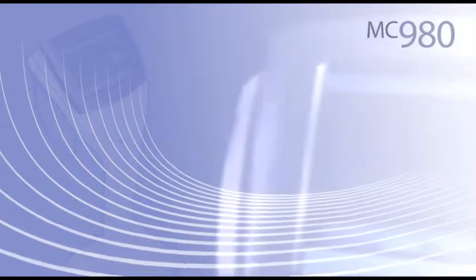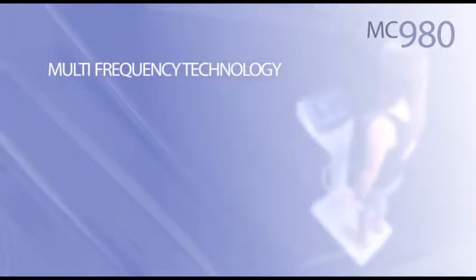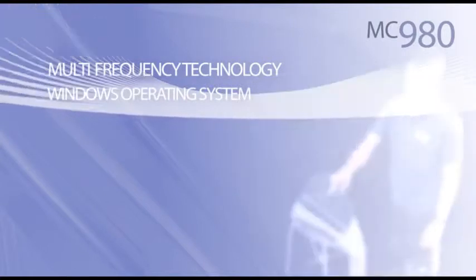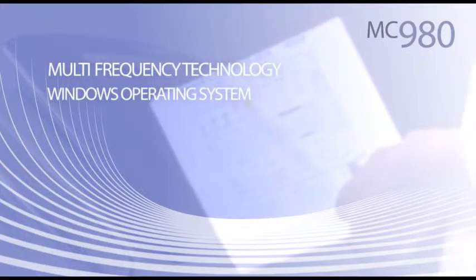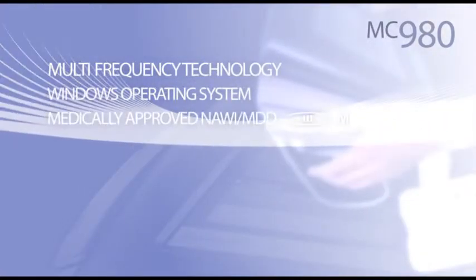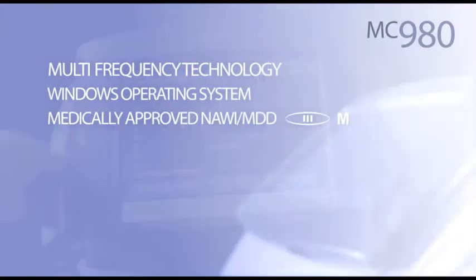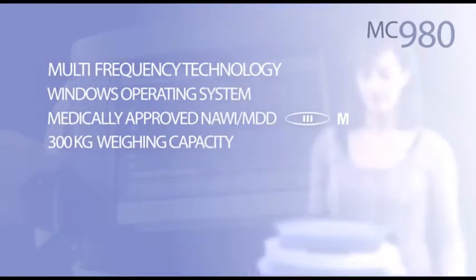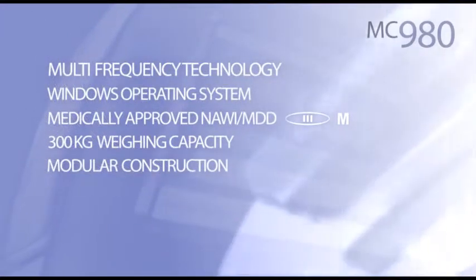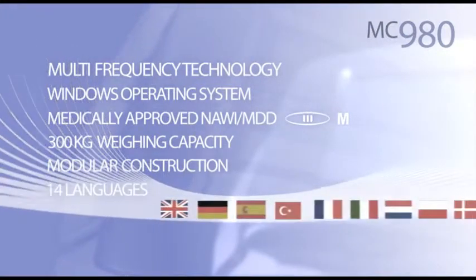The MC980 segmental body composition analyzer. Clinically validated Tanita multi-frequency BIA technology using six frequencies. Flexibility of the Windows operating system enables comprehensive user data management and analysis for consulting and progress tracking. Awarded NAWI and MDD approval for use in medical treatments and consultations. With a weighing capacity of 300 kilos calibrated up to 300,000 uses. Modular and robust design for easy setup and minimum maintenance.